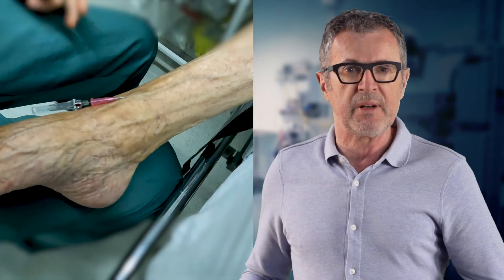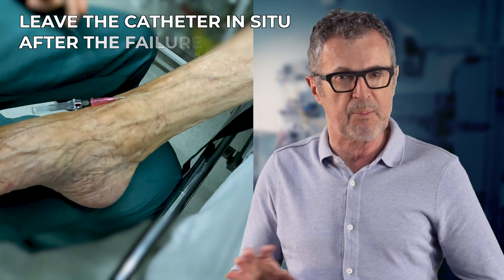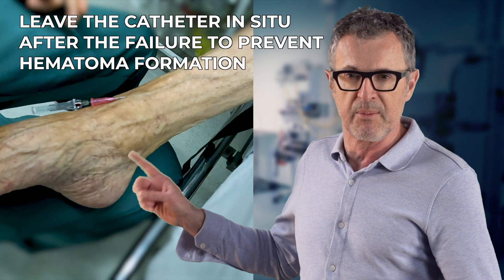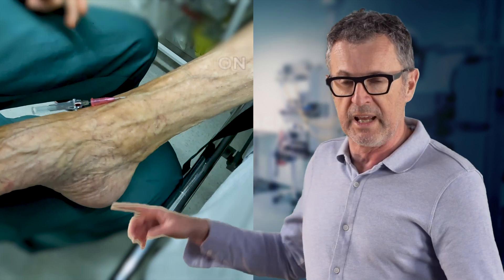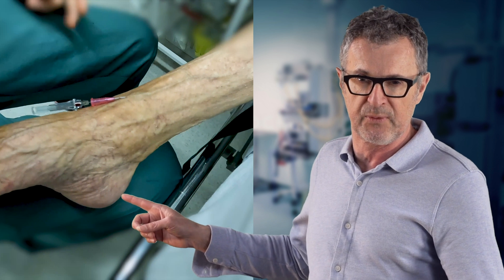When this happens and the IV line insertion fails, simply leave the failed catheter in place until the new IV is secured, in order to avoid expansion of the hematoma at the first attempt site.